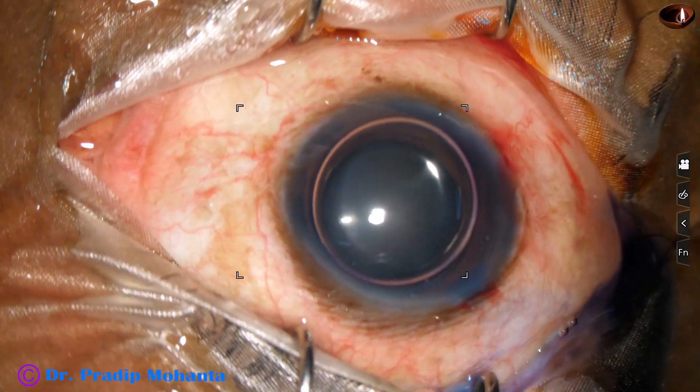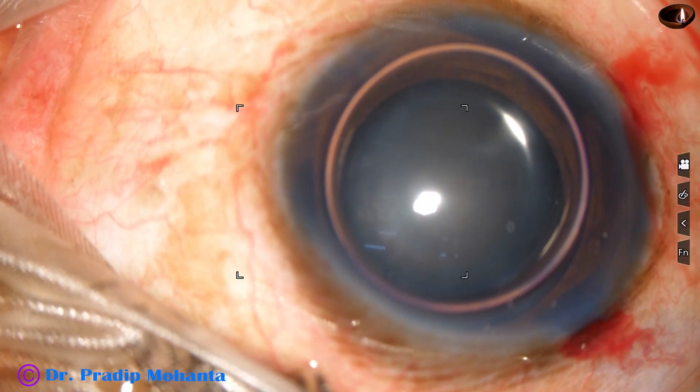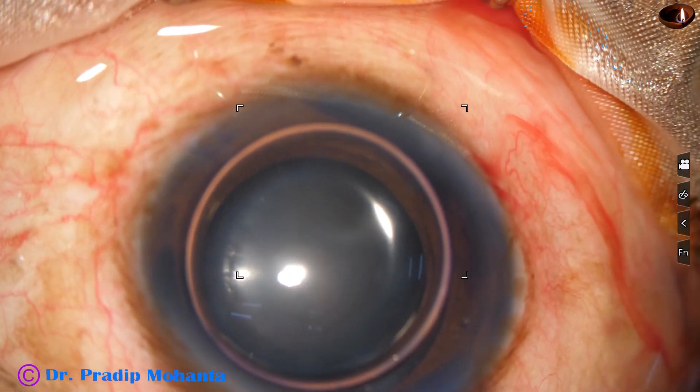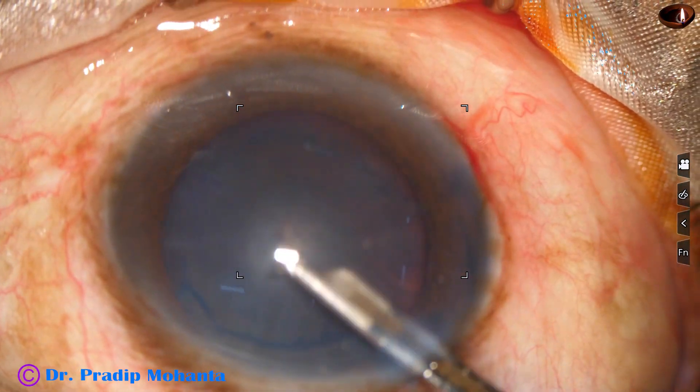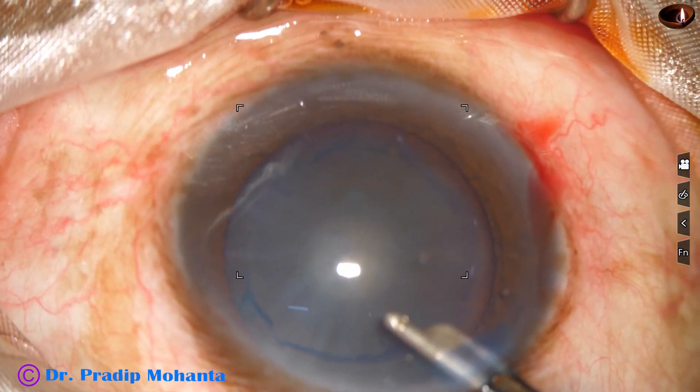An air bubble has been injected and beneath this air bubble trypan blue dye has been applied over the anterior capsule, and there is uniform staining of the anterior capsule. We can see the pseudo exfoliation material has also been stained.